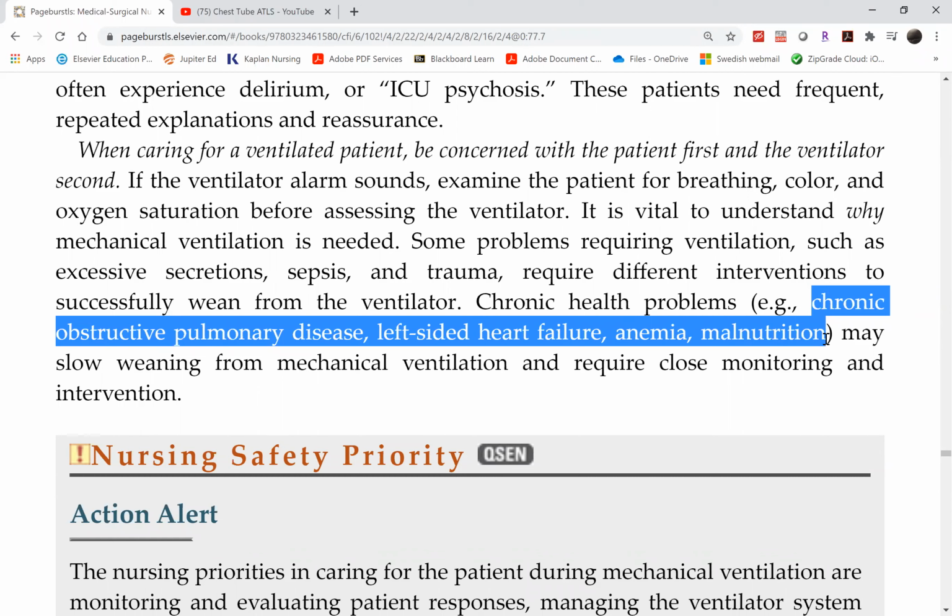We did have negative pressure ventilators during the first few models that were developed, because they tried to mimic it. The only way to do it was to wrap the patient in a steel cylinder with only the patient's head sticking out, and then we have tubes sticking out of that big cylinder sucking the air out, causing a vacuum, mimicking the diaphragm, so that air is sucked into the patient's lungs passively.